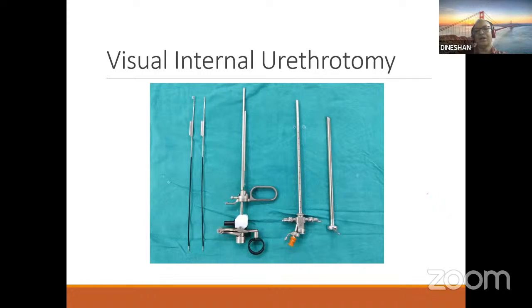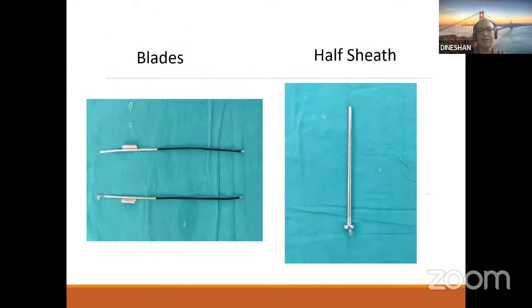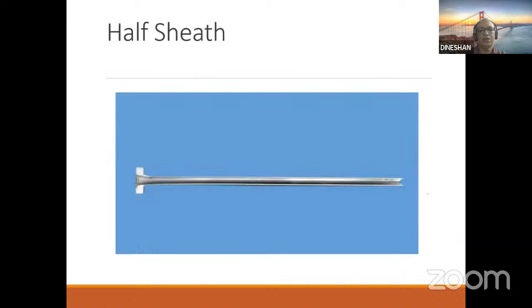And the half sheath always permits a 14 French. So you can see the groove here. This will permit a 14 French catheter, so that through this you can always introduce it.